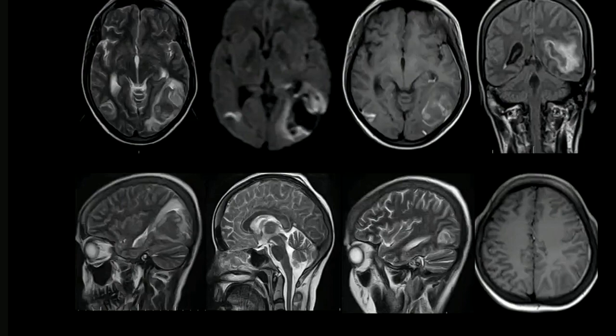Just a minute. It's a T1 image. Coming to the bottom row, the first three are sagittal images — starting from FLAIR, then T2, then again. Why is the first one in the second row FLAIR?